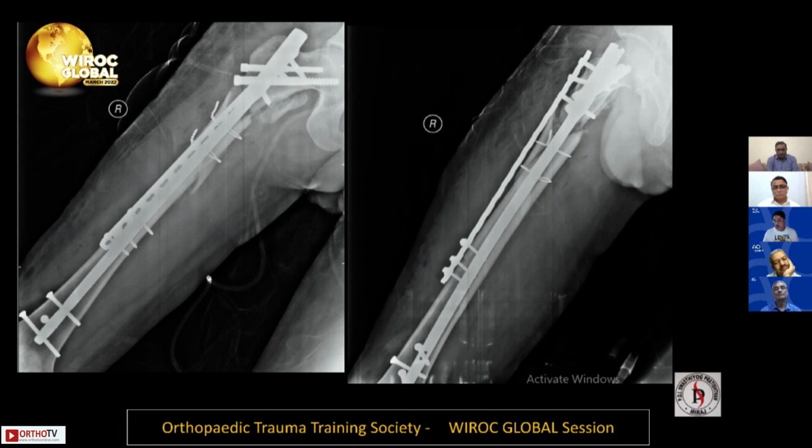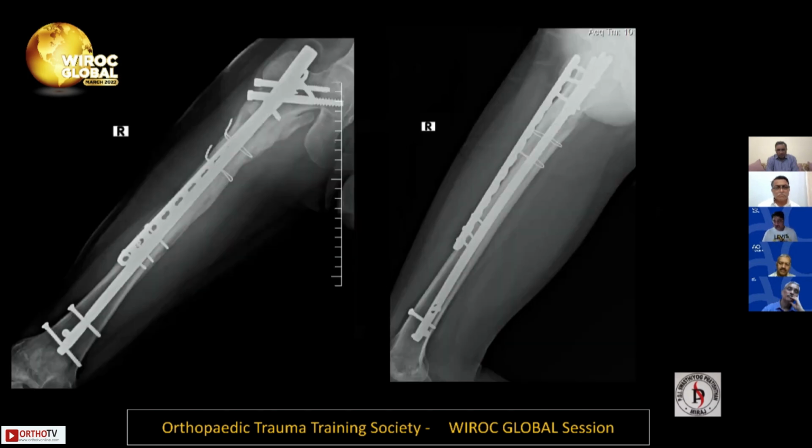Though it is a comminuted fracture, and everybody will think about relative stability because of the pieces, I felt on the fracture table, when we checked the rotations, there was a slight movement on image. So I thought this fracture was going to trouble us in future and break the nail. We did this, and exactly as suspected, it gave a good callus in spite of having both combo implants.